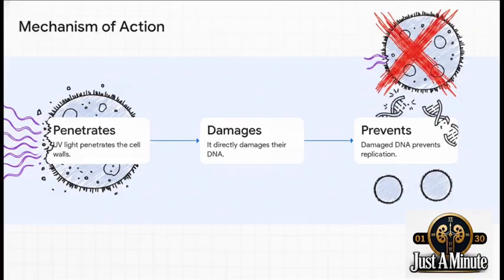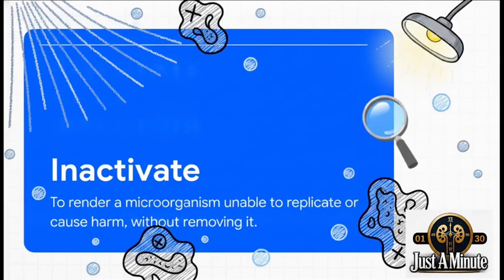Basically, game over. The exact terminology used in the source data here is really fascinating, and it's the word inactivate. It literally means to render a microorganism completely unable to replicate or cause harm without actually physically filtering it out of the water. So remember, UV does not filter, it inactivates. The organism is technically still floating right there, but it's been rendered entirely harmless.